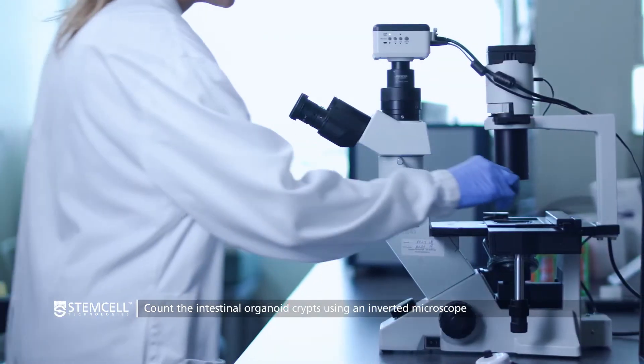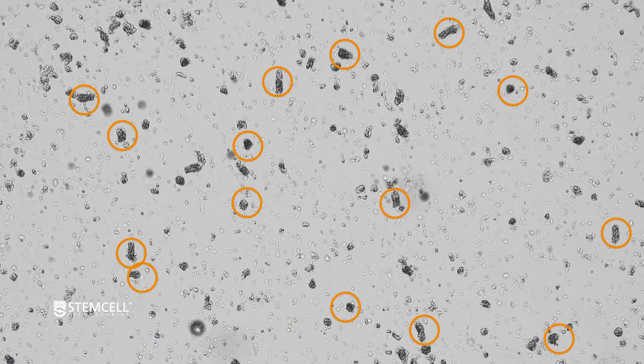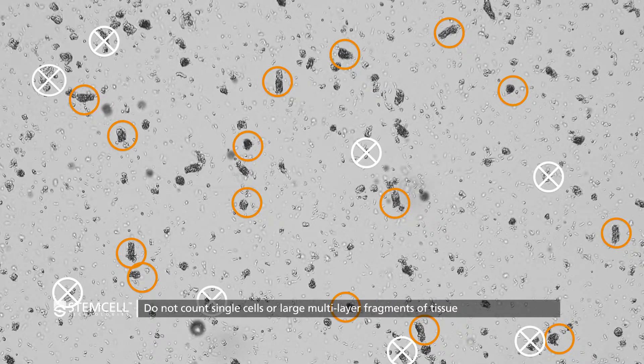Count the crypts using an inverted microscope. The crypts look like small folded sections of the epithelia. Do not count single cells or large multi-layer fragments of tissue.